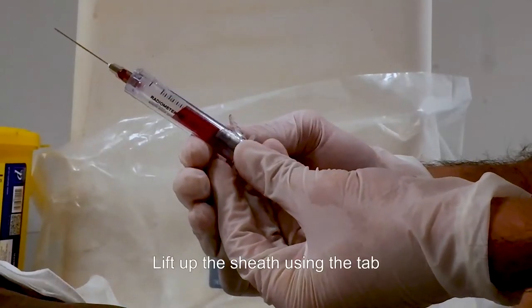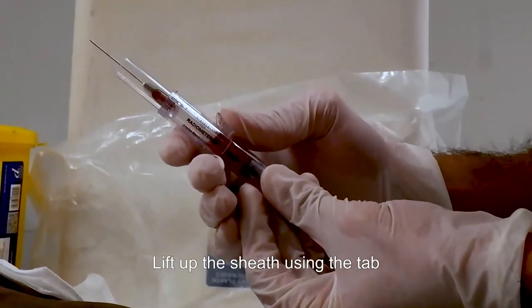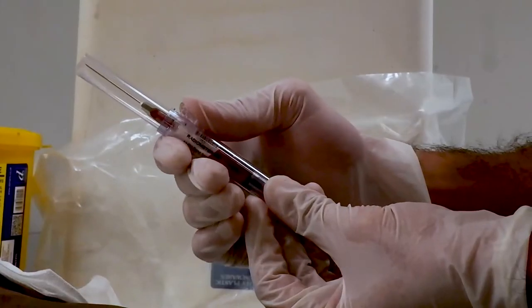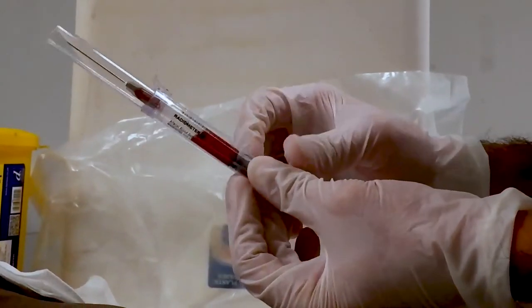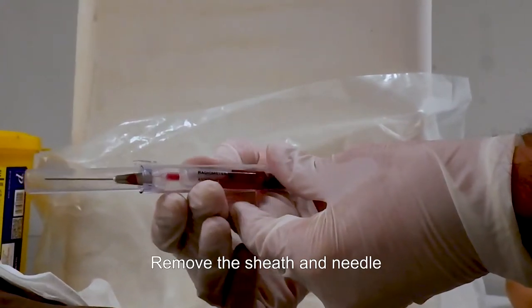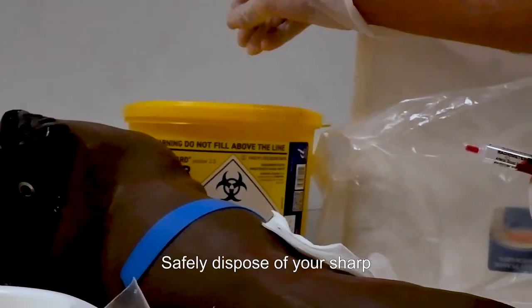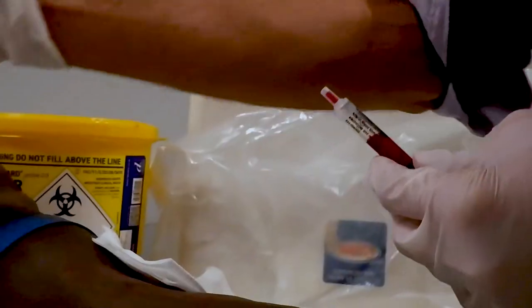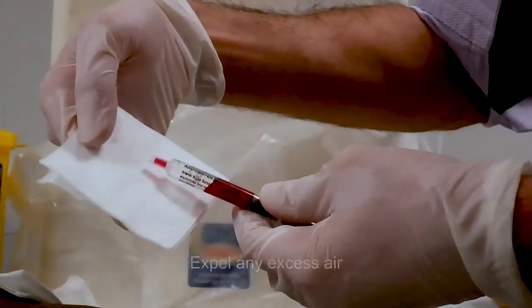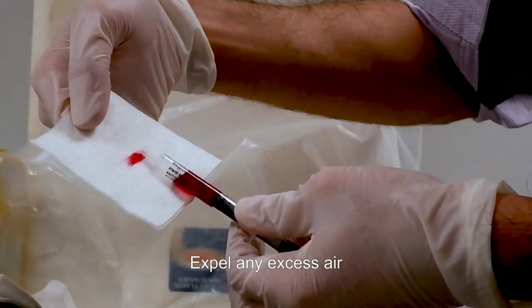Using the tab, lift up the sheath to cover the needle — it will click into place. Remove the sheath and the needle from the underlying syringe. Dispose of your sharp into the sharps bin. Expel any excess air from the syringe into a piece of gauze.